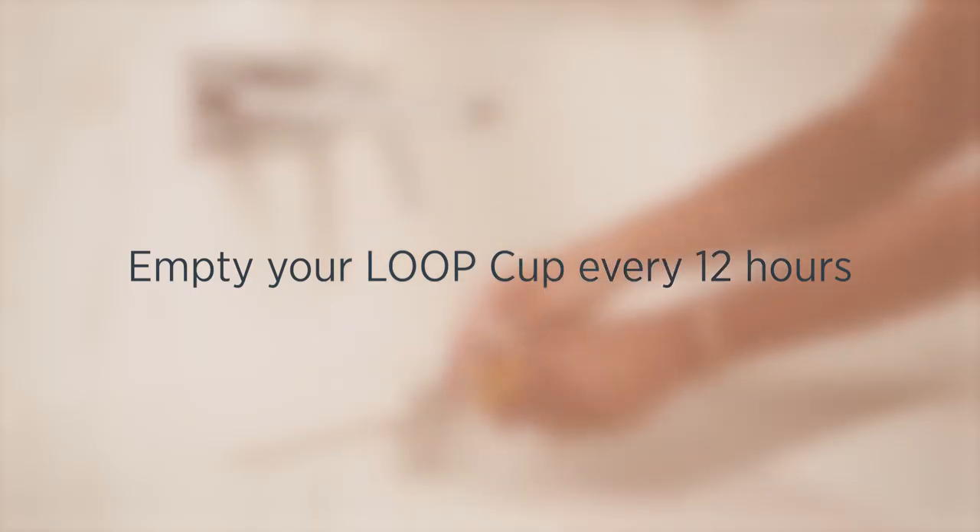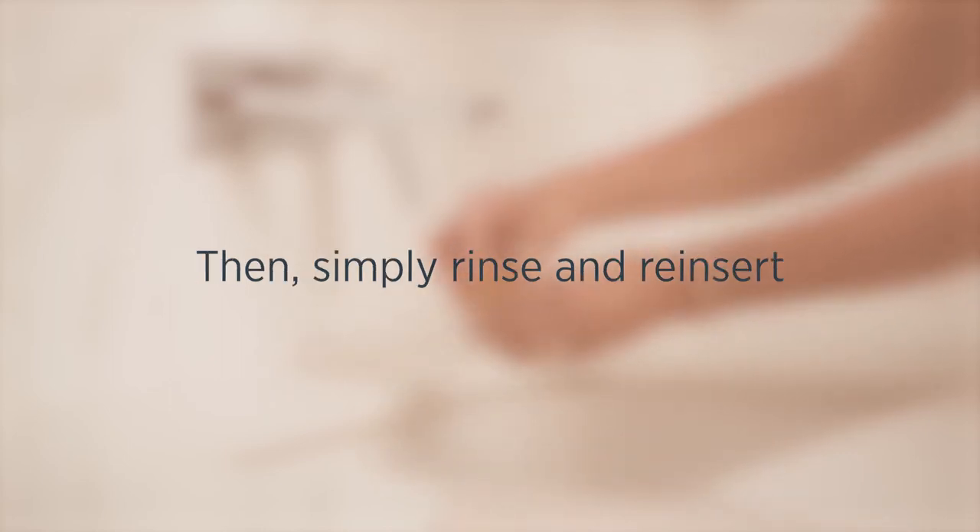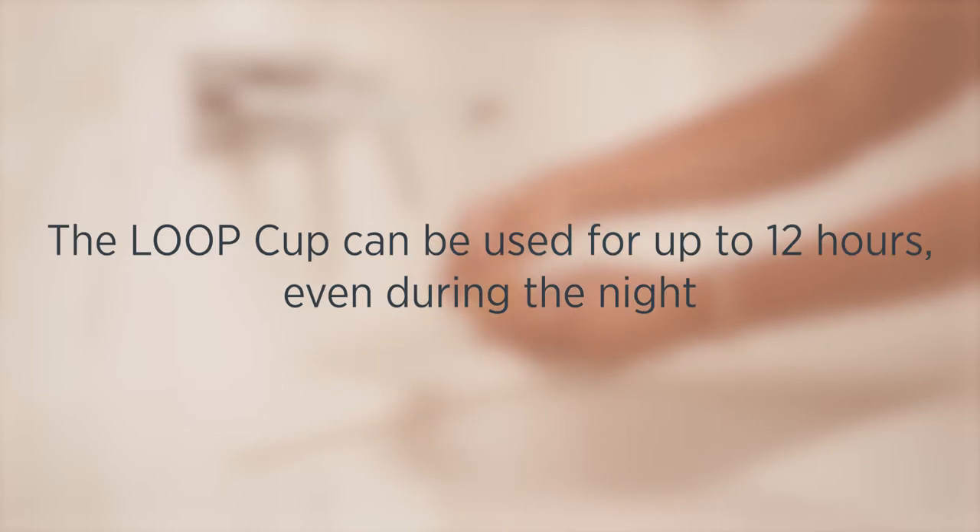We recommend to empty your Loop Cup every 12 hours, then simply rinse and reinsert. The Loop Cup can be used for up to 12 hours, even during the night.